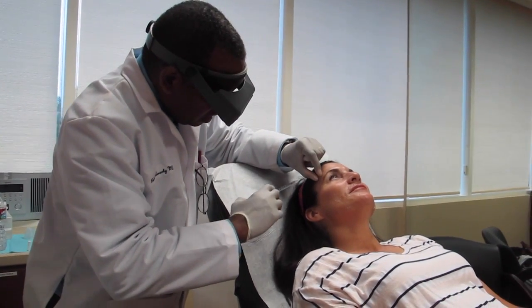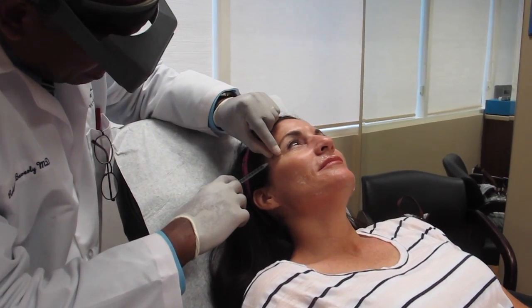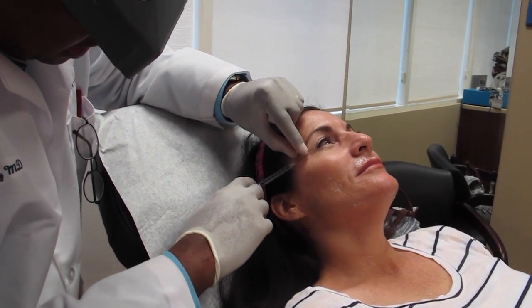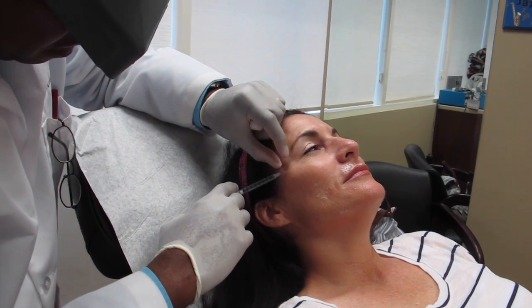And we're gonna put a little around here. Usually in a situation like this, I'm gonna do about 20 units around here. And what I do is kind of a little fan pattern around the eye is what I use.